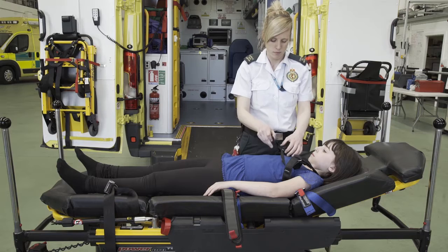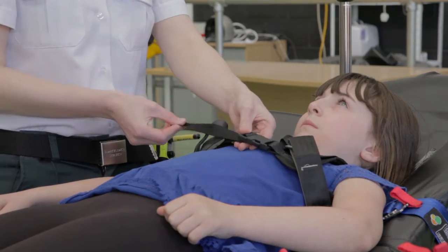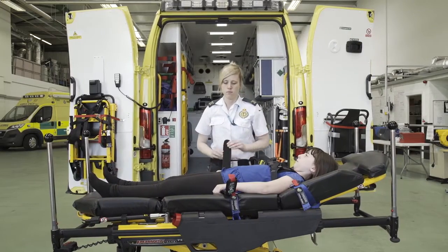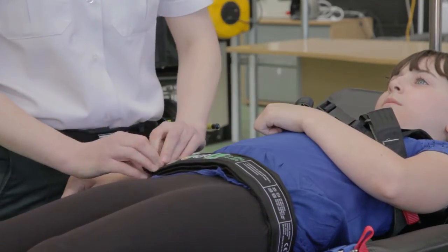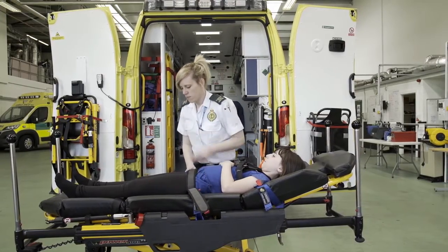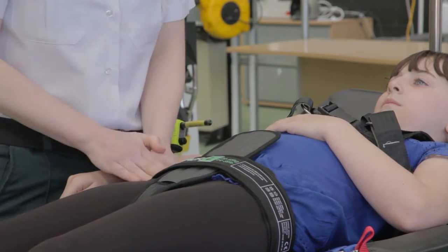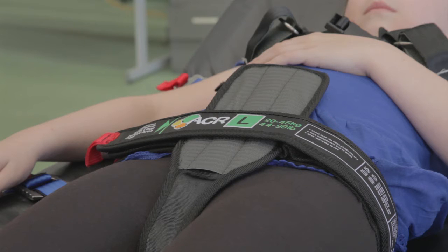Repeat this on the other shoulder and then secure the chest strap. Bring the single waist strap across the child's waist. Fit and engage the double waist strap across the single waist strap and press firmly together. Lift and peel back the outer waist strap with the red tab. Position the crotch strap centrally. Close and engage the outer waist strap and press firmly together. Ensure the markers have sufficient hook and loop engagement in the contact area.